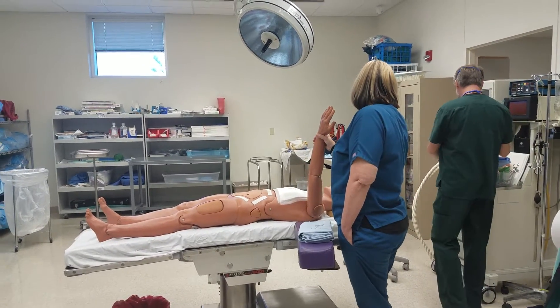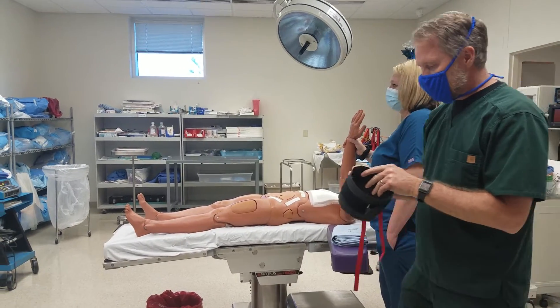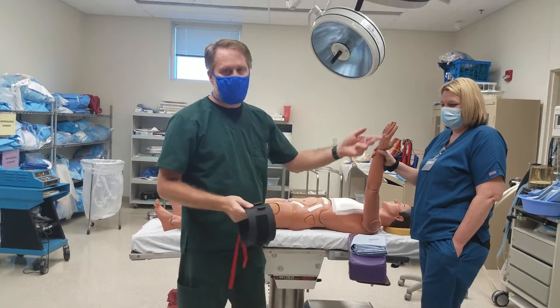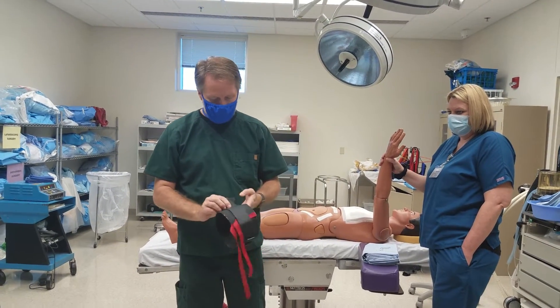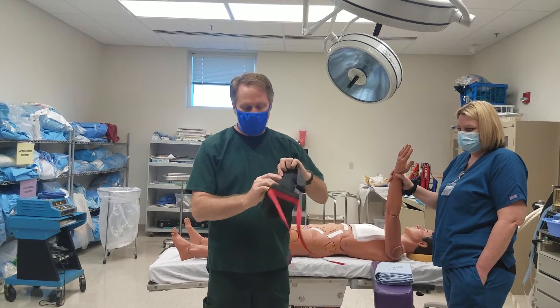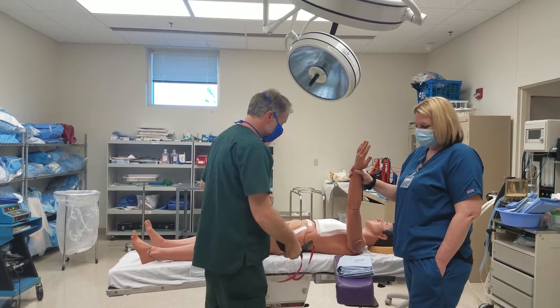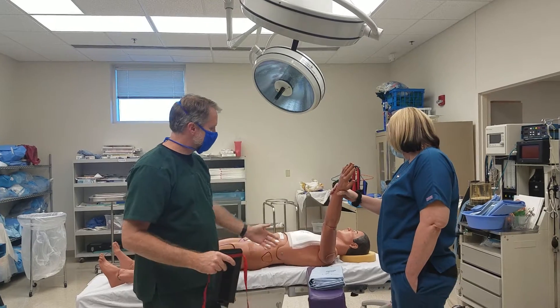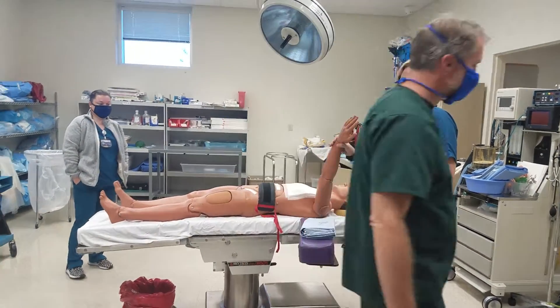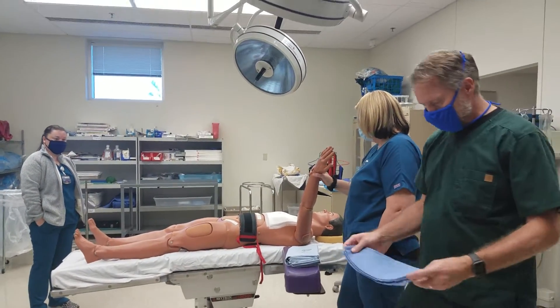The tourniquet we're going to use might look something like this. This is an example of a tourniquet we've used — it has lines off of it. The control box usually sits on an IV pole; anesthesia runs this thing. This is a single channel — just one inflatable tube inside. Some have two. It's going to go as high on the arm as possible to give as much run down here as possible. This typically doesn't go directly on the skin, so it would be a good idea to put a towel around there first.